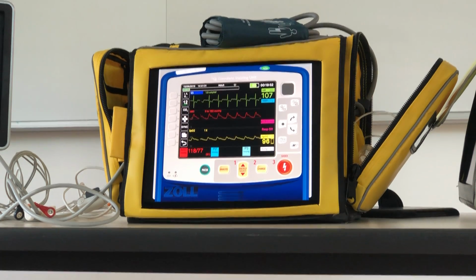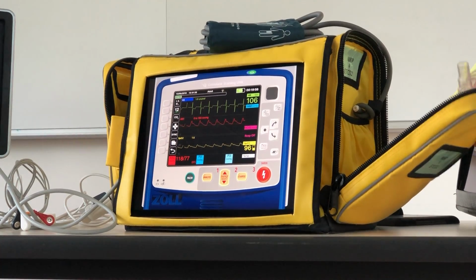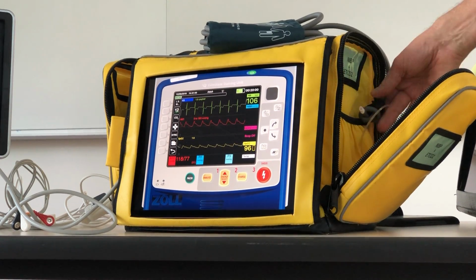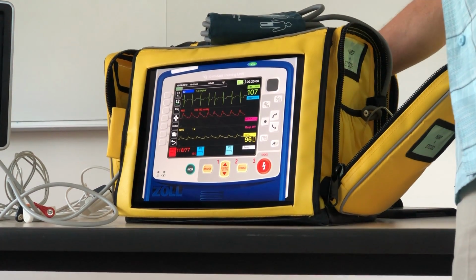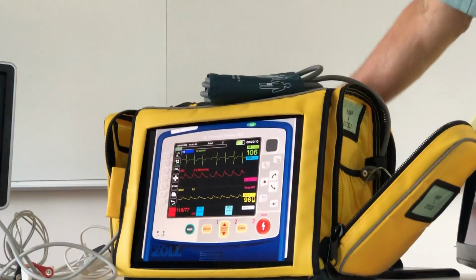Stick them in a pocket? So inside the little side pouches, they've got little Velcro things. So that one's Velcroed in. This one I've got a knot tied in it so the tube doesn't fall out. So they've got a couple little Velcro keepers here and there. What I haven't figured out a great way for is if you're going to do defib pads, that's the electrode one, defib's in the other.